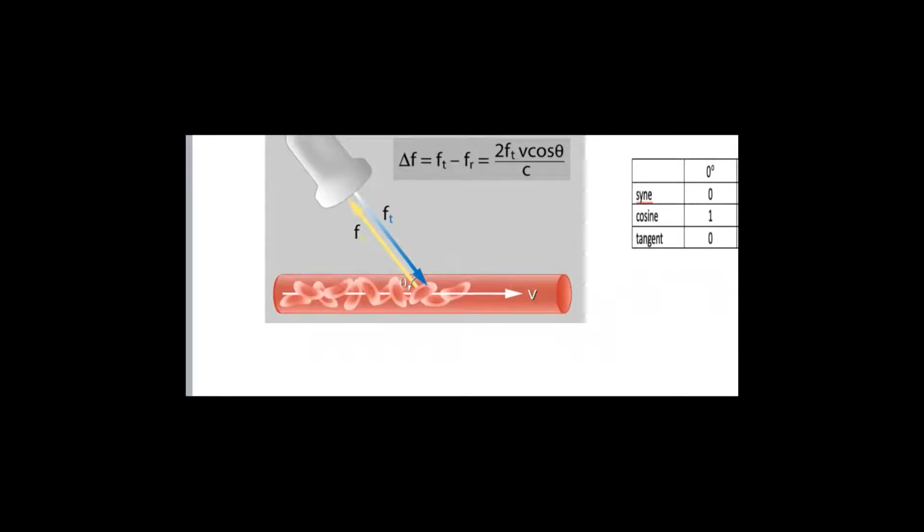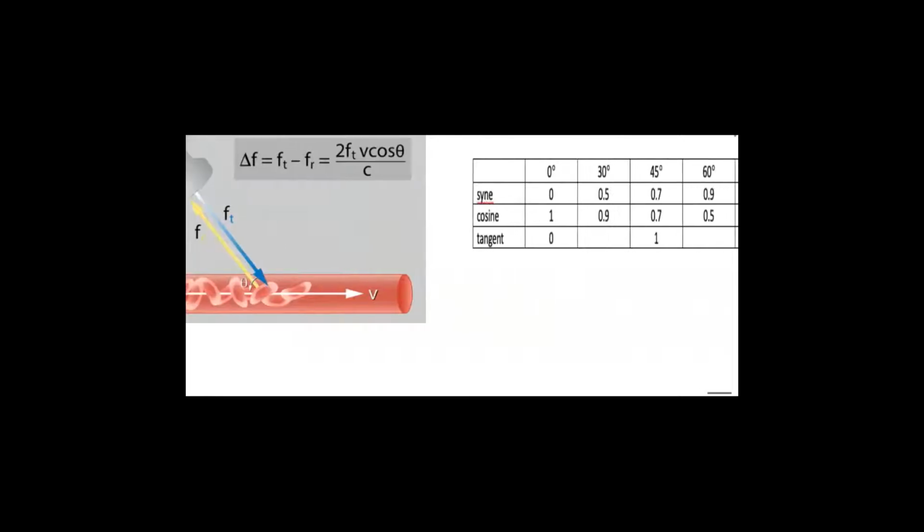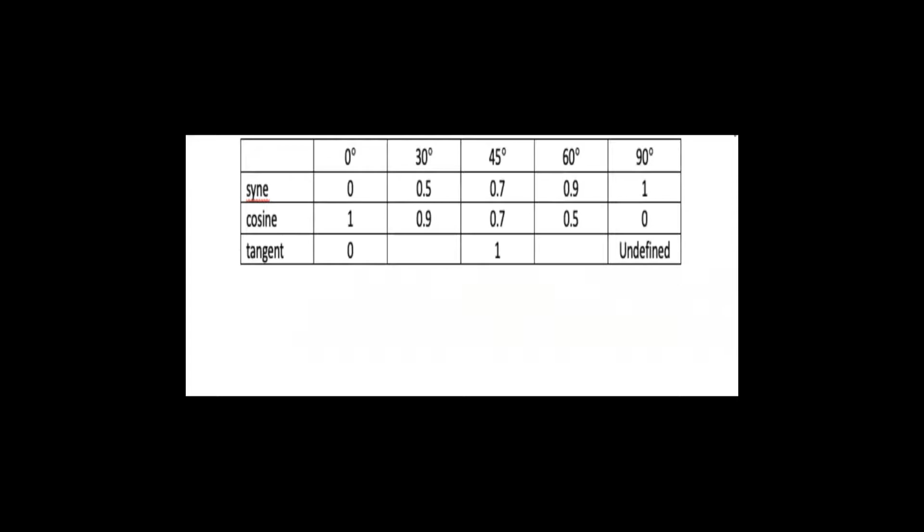Cosine theta means what, mathematically, in Arabic? When we say cosine, معناته بنقصد شنو؟ جيب الزاوية. جيب التمام مش كده؟ ايوه جيب تمام الزاوية. طيب look at this one here. This is from the table of sine and cosine. The cosine of 0 angle is 1. The cosine of 90 is 0. So the highest cosine is 1, and the lowest cosine is 0, and in between.